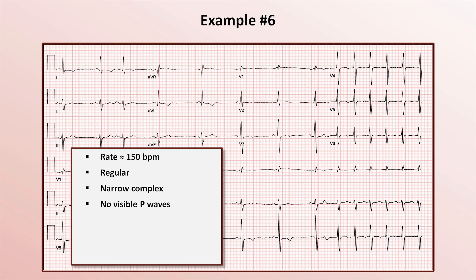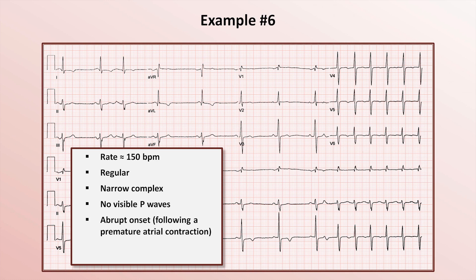Although it has not come up in the five prior examples, do you remember question number 6? Part of it asks whether the onset is abrupt or gradual. It looks like a very abrupt onset here, one which followed a premature atrial contraction.